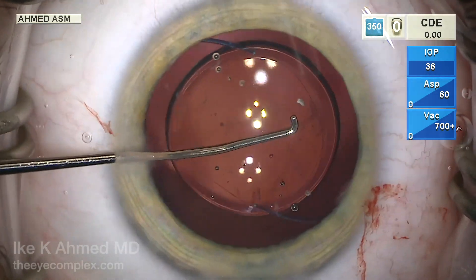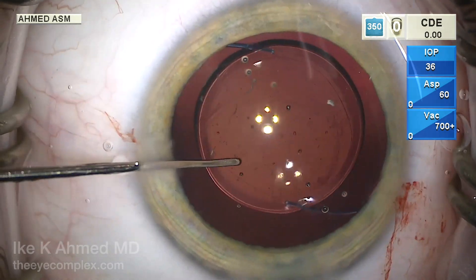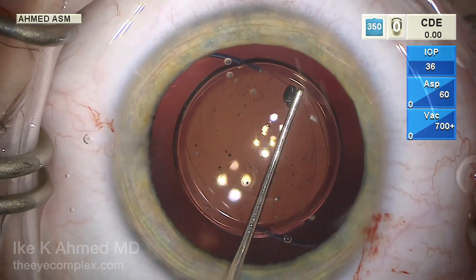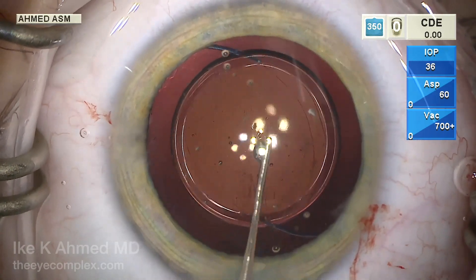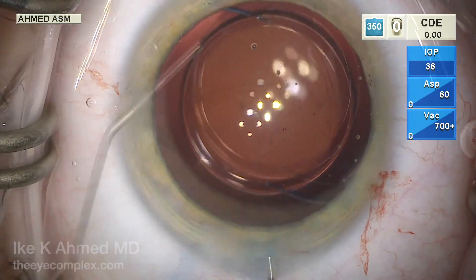More importantly, we can now place this lens in a posterior optic buttonhole position without vitrectomy, because there really is no need for vitrectomy. There's no scaffold for lens epithelium to grow onto. The optic captured here prevents migration centrally, although there will be some proliferation in the peripheral capsule — the plastic of the optic will prevent that from reaching the central visual axis.